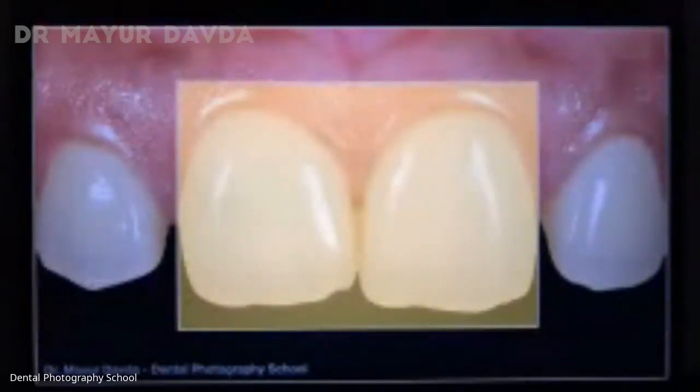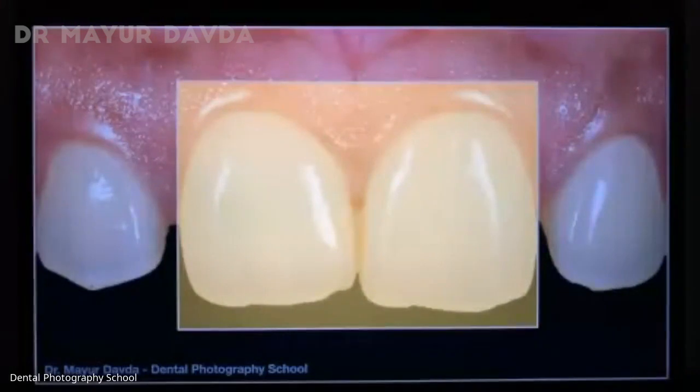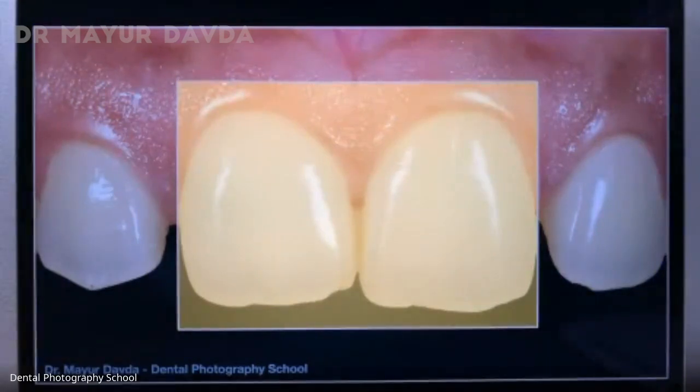Okay. So we spoke about flash, we spoke about lenses, and we spoke about DSLRs. The flashes are inbuilt flash, twin flash, ring flash, and studio light. And for lenses, there's only one lens, that's a 100 mm macro lens. But if you're a Nikon user, then it's an 85 mm macro lens or a 105 mm macro lens. So I'd probably just want to take a break over here and actually show you the lenses.